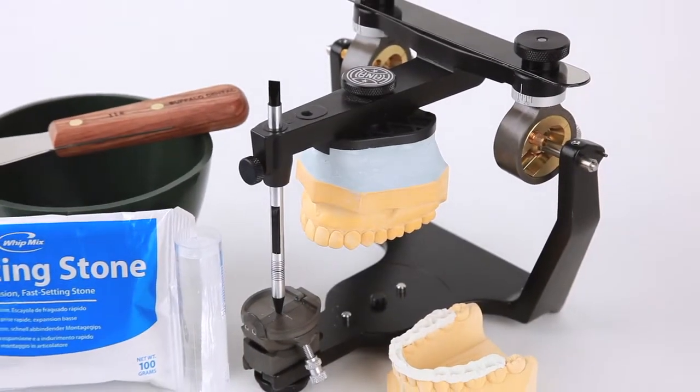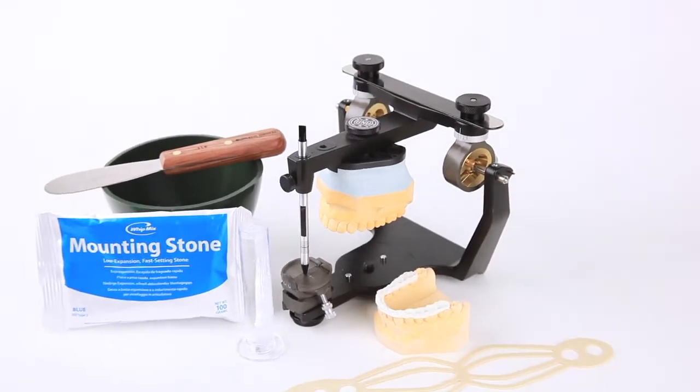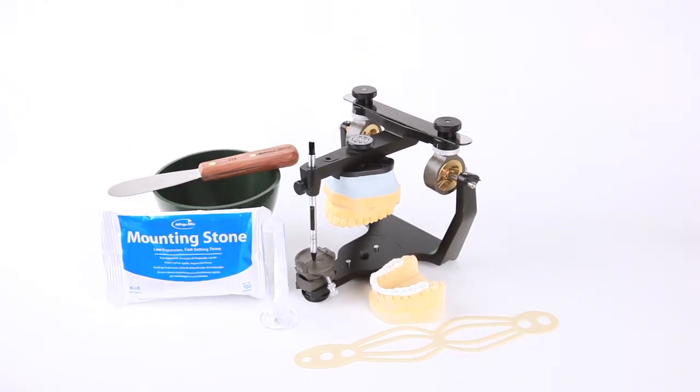This demonstration video is designed to show the proper use and advantages of the flexi-mount stabilization system when mounting casts to an articulator, which has a thumb screw on the top arm of the articulator. This demonstration also shows mounting of the casts with bite registration.